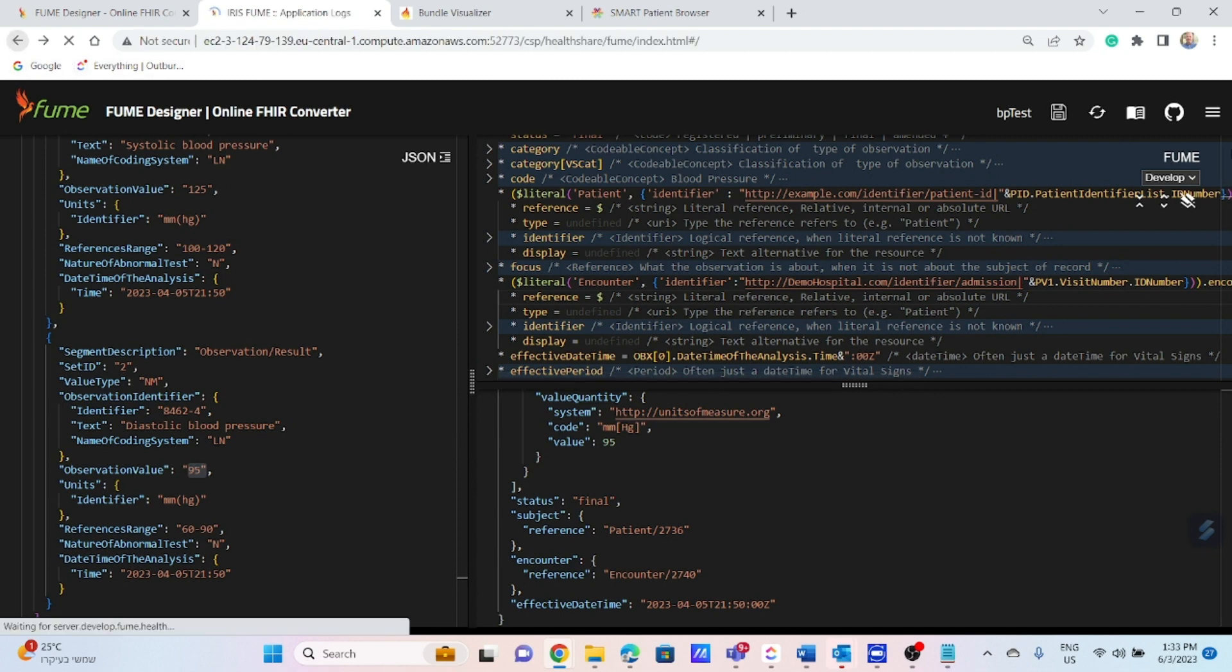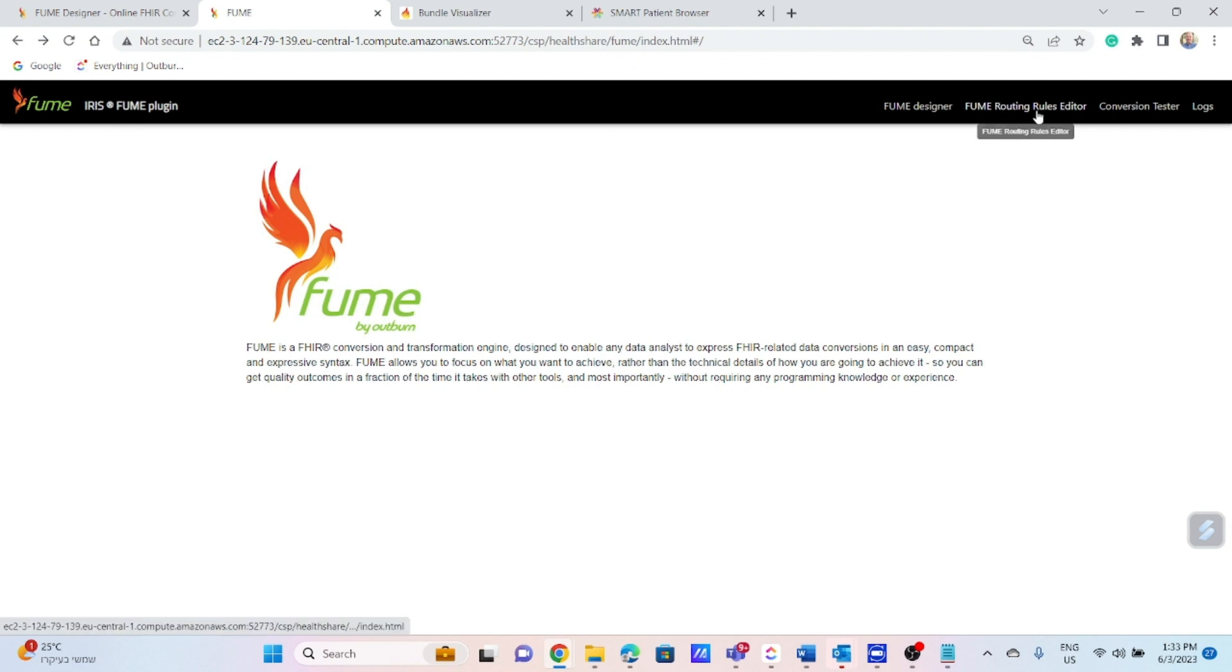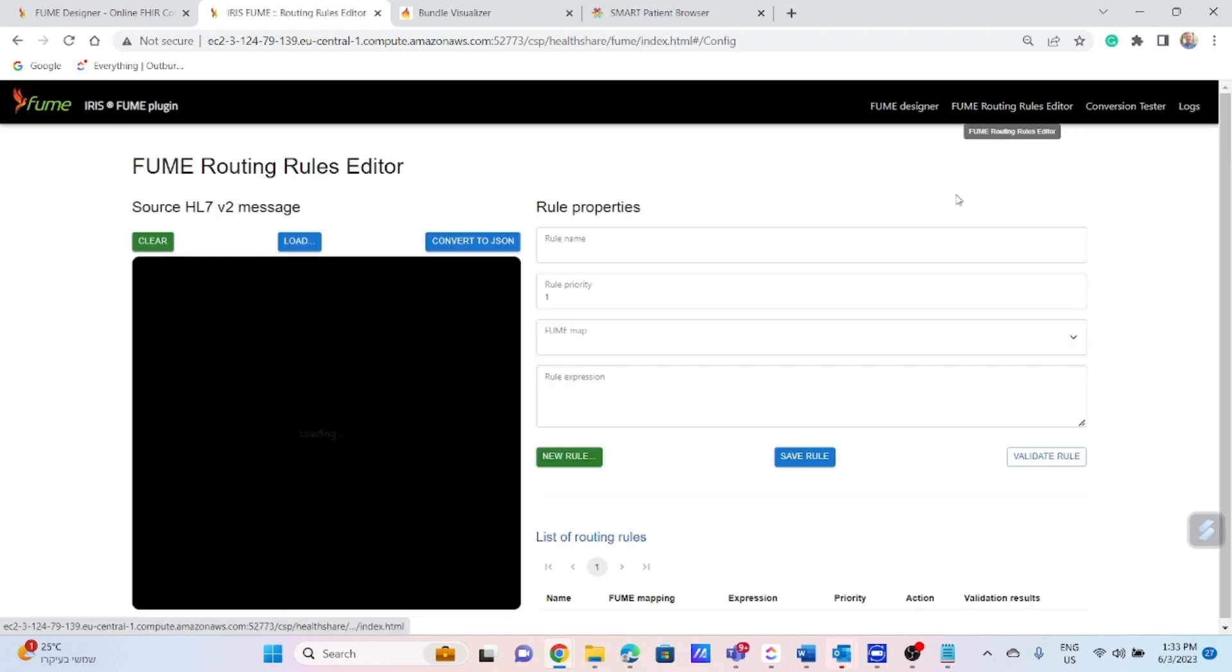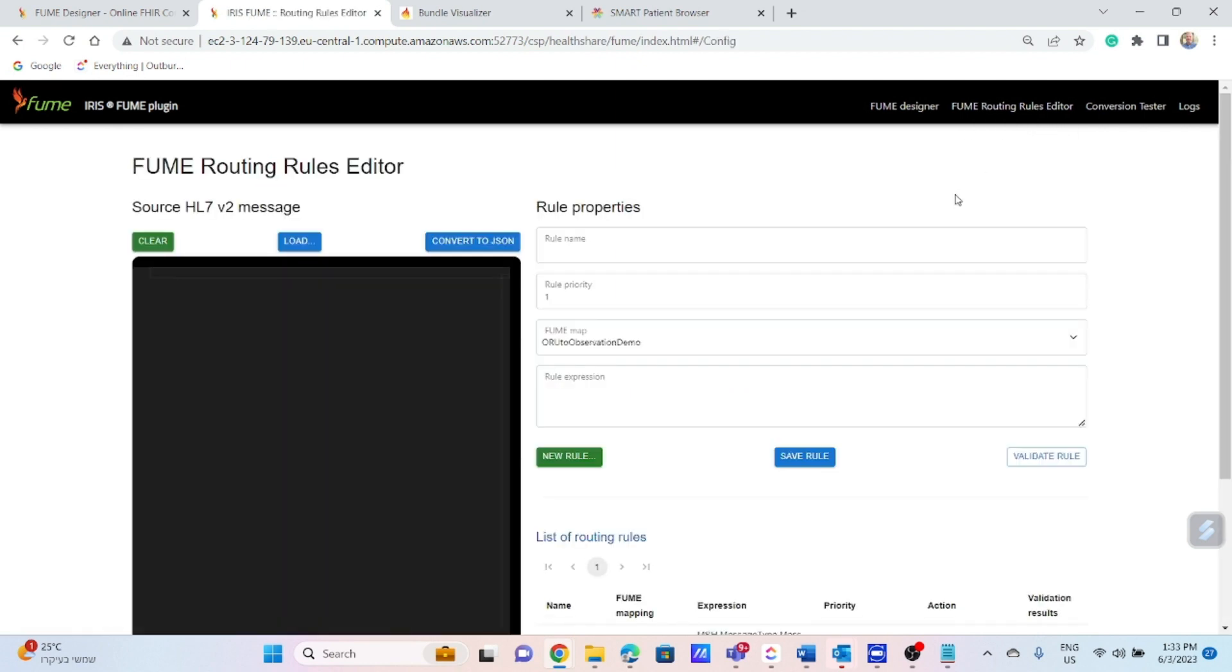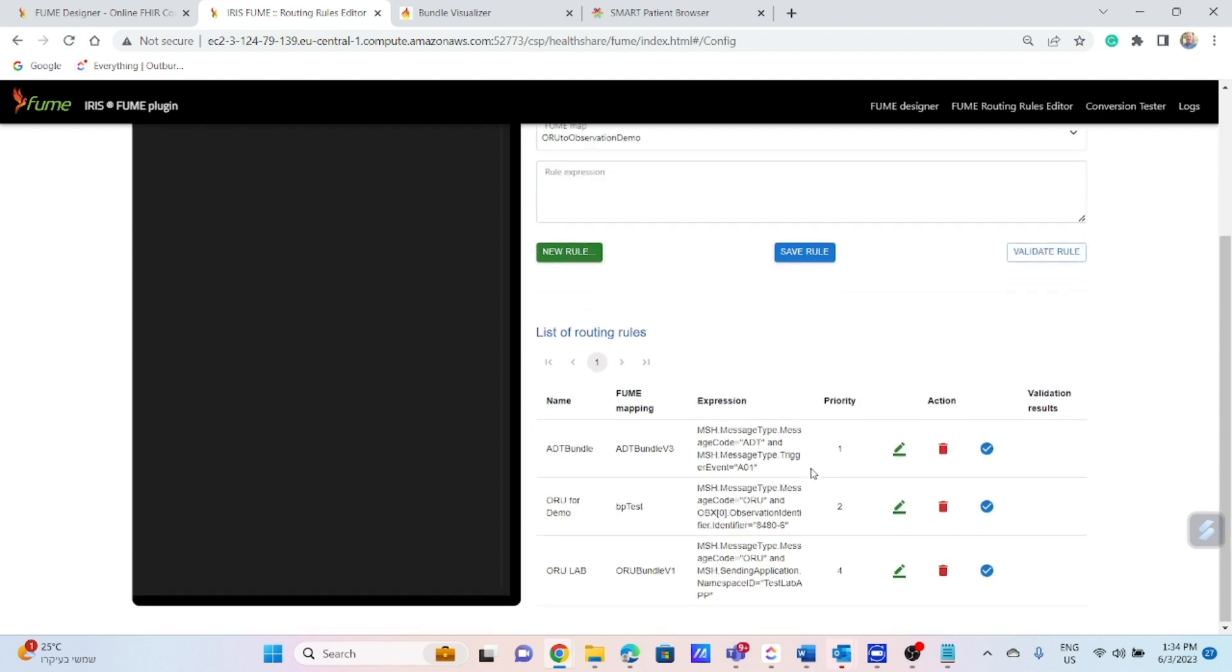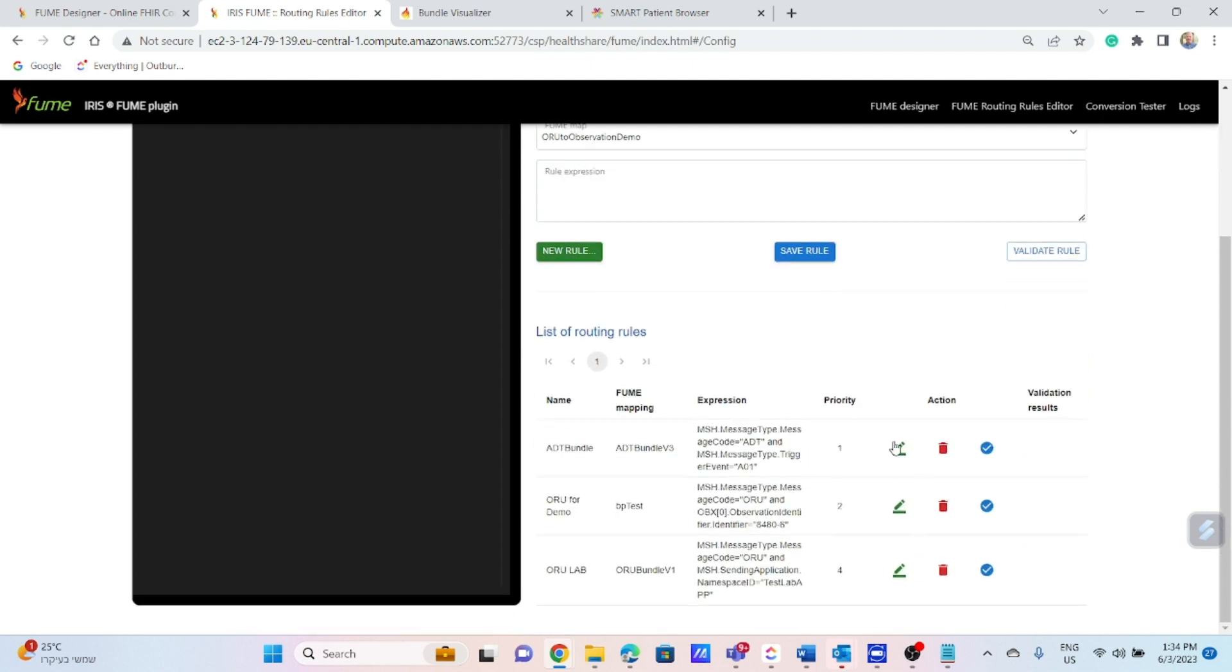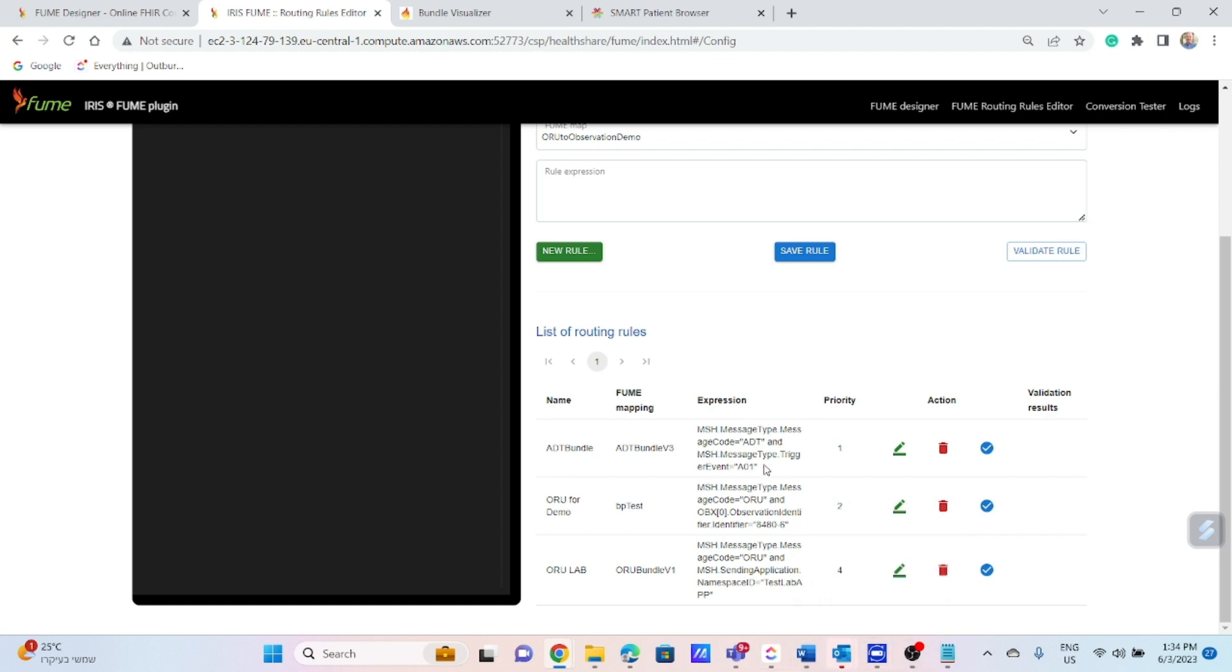The next step, we will set the routing rules, which calls the appropriate map based on the logical expression for each of the source messages. The expression syntax is based on Flash and provides broad flexibility to set any logical condition. The rule set is created once for each incoming source message type and can then be reused as often as needed. In the list below, you can see previously defined rules for different types of incoming messages as an example for ADT HL7 V2 message.